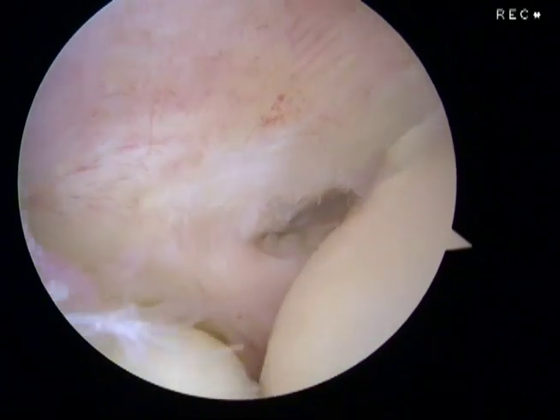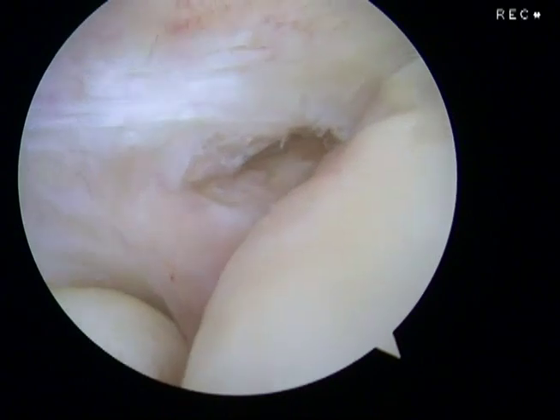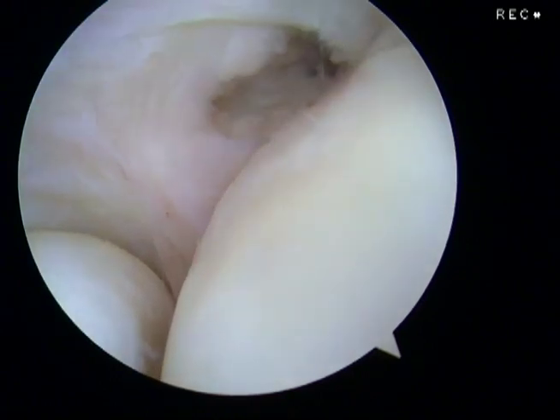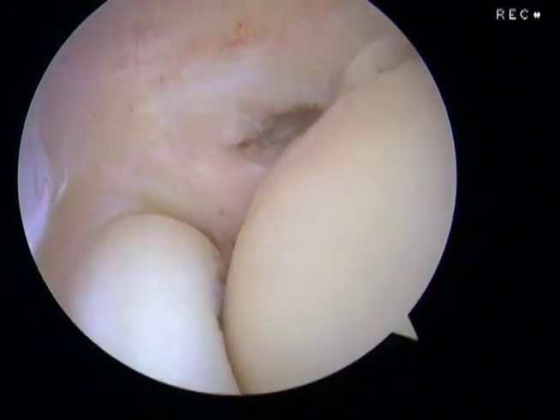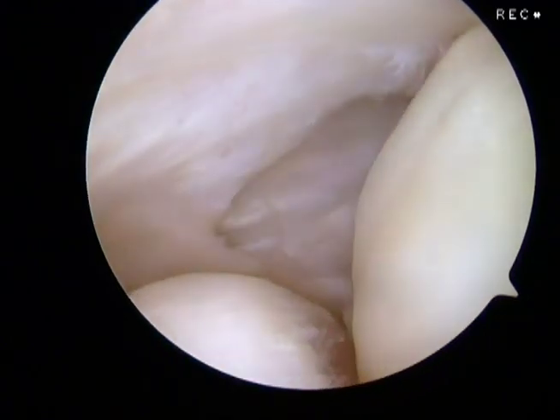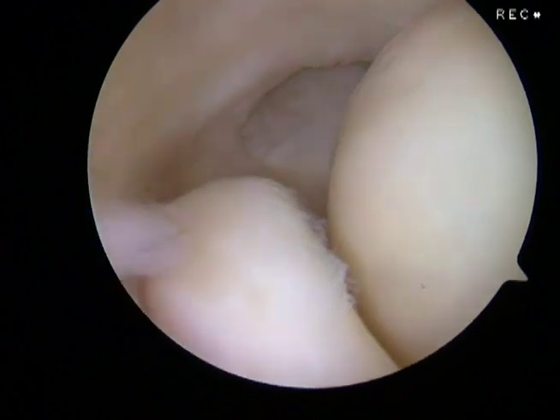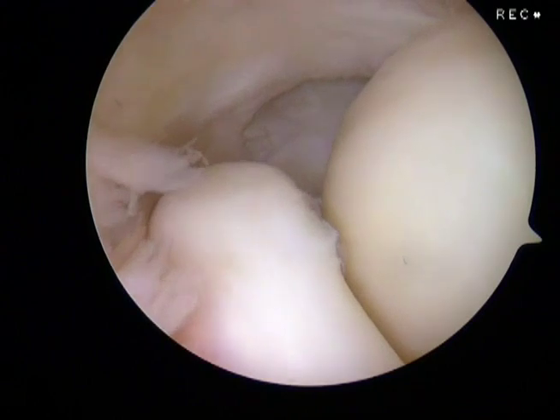Case number 7, again a type 3 Baker lesion with evidence extra-articularly that there may be some loss or failure of a portion of the ECRB tendon. In this last example, again a type 3 Baker lesion, note that there's extensive capsular loss and exposure of essentially the entire tendinous portion of the ECRB tendon in this patient with lateral epicondylitis.